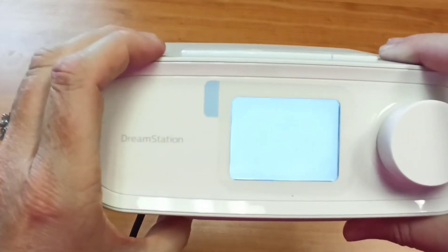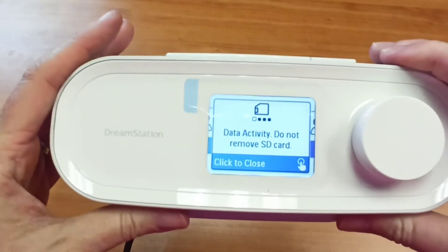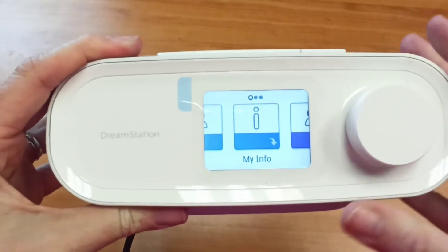When you're done for the day, you just shut the whole thing off. Every time you turn it back on, it will start again at your prescribed pressure. So you do have to ramp every time you use it.